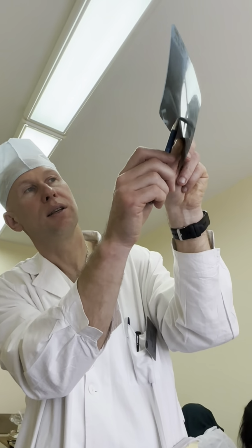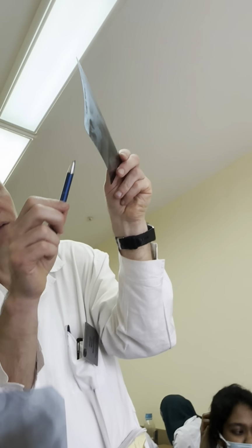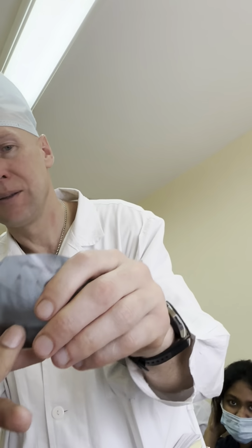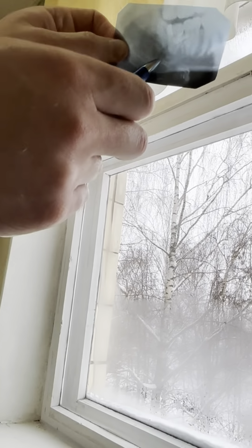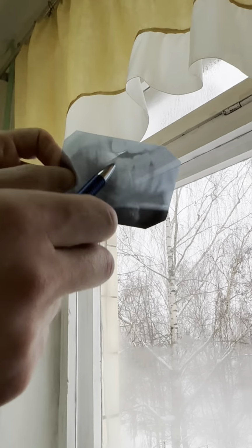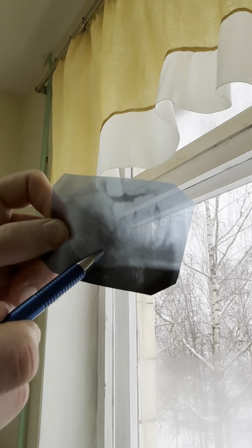This is a foreign body inside the nose. Foreign body. Yes, a fracture near the wisdom tooth. And the wisdom tooth is in the fracture line. We should remove this wisdom tooth. Doctor, this is the fracture. What? This is fracture.